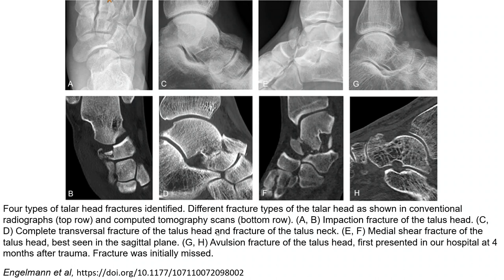Four types of talar head fracture are identified in this study. Different fracture types of talar head are shown on conventional radiograph on the top row, and CT scan on the bottom row. Images A and B show an impaction fracture of the talar head. Images C and D show a complete transverse fracture of the talar head and fracture of the talar neck. Images E and F show a major shear fracture of the talar head.